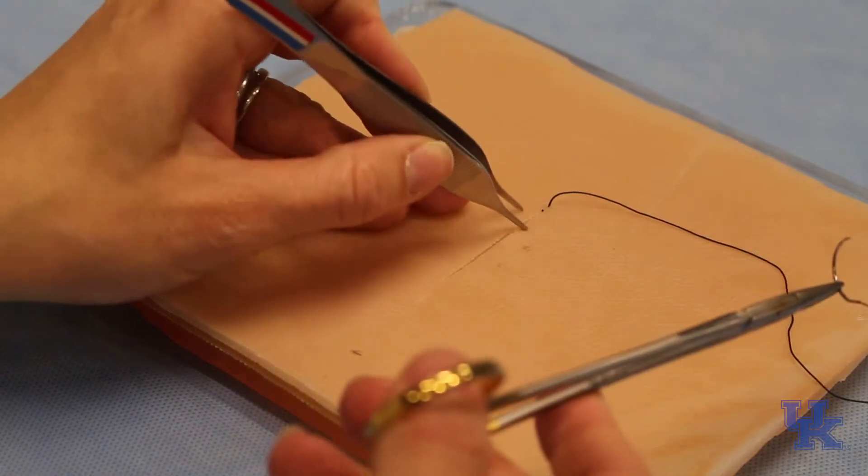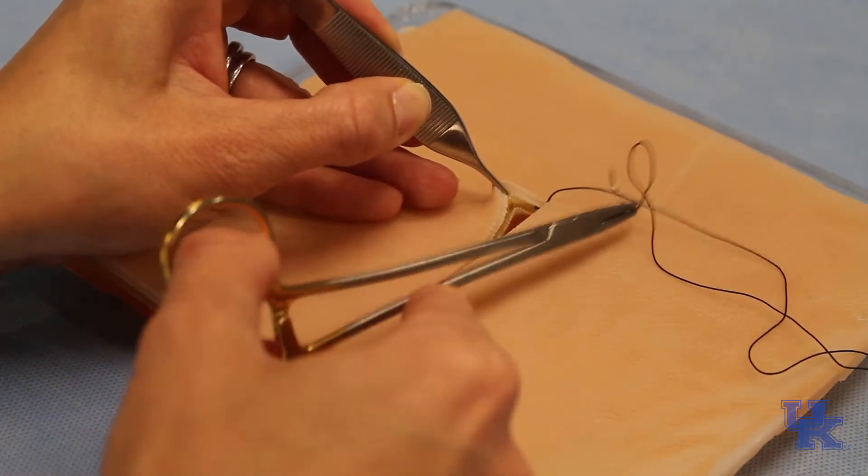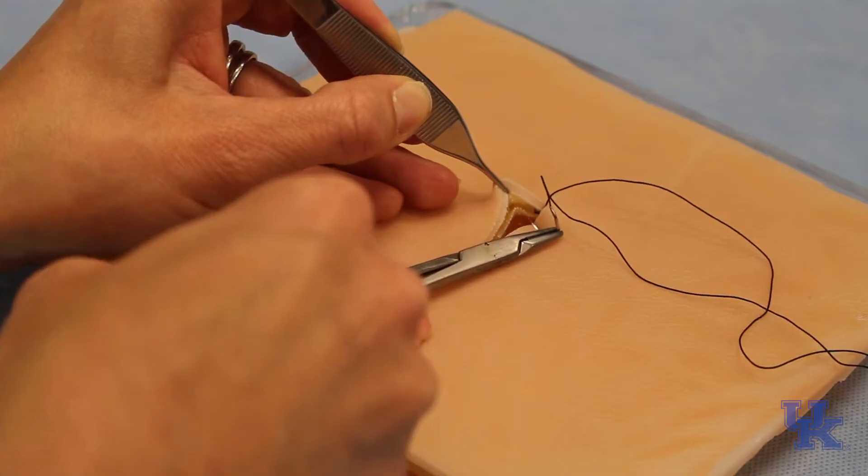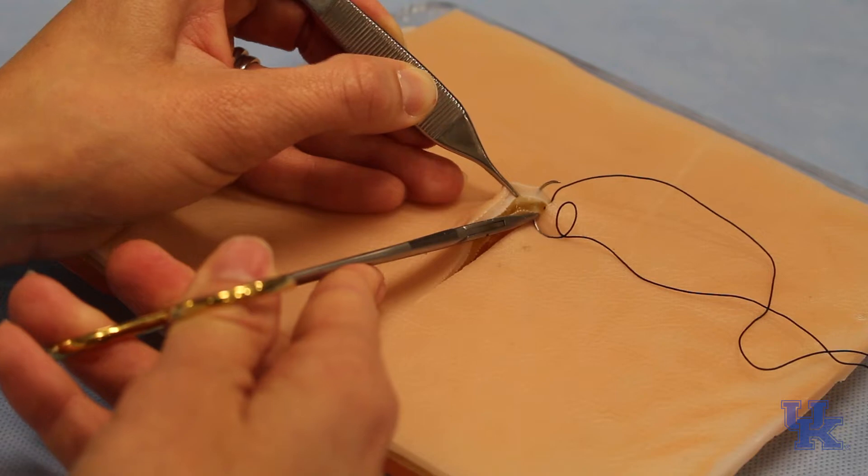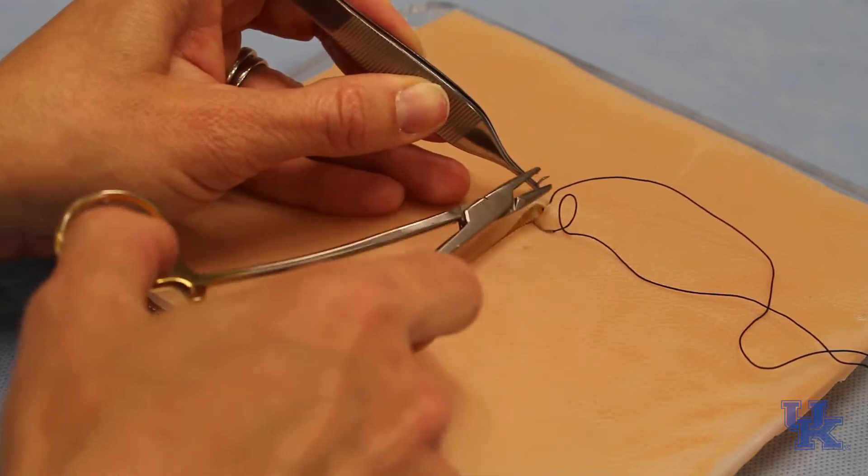Now that we've buried that knot, our knot is deep, which means that this suture is coming from deep. So we have to once again start deep and then come back out to our superficial plane, right below the epidermis within the dermis.